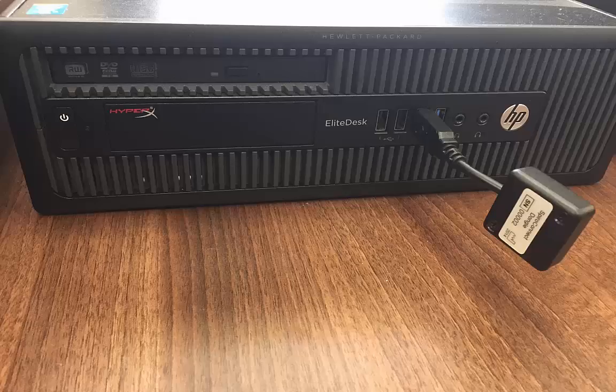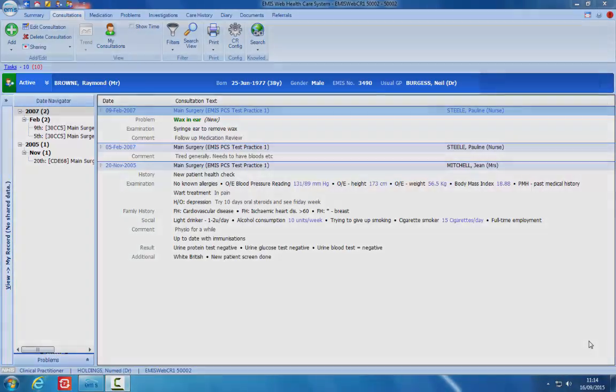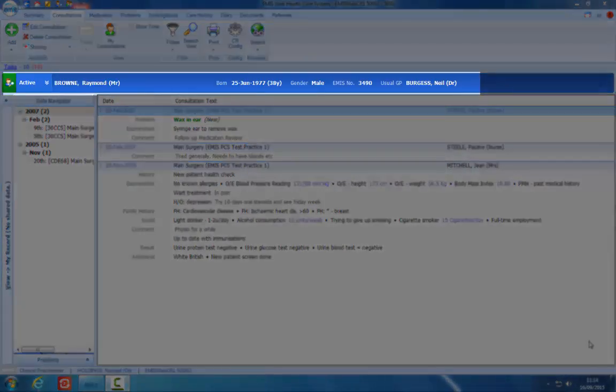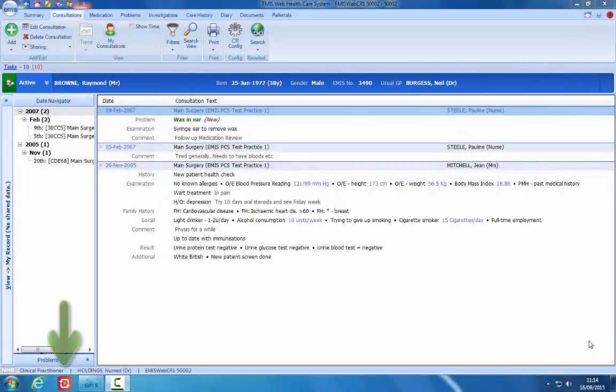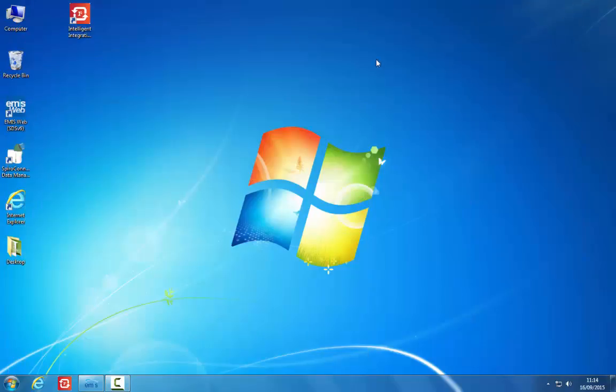Before starting the test procedure, be sure the SpiroConnect wireless receiver is connected to a USB port on the PC. Ensure that you have the correct patient open within the clinical system. Click the i3 icon on your taskbar or desktop to start the integration software.